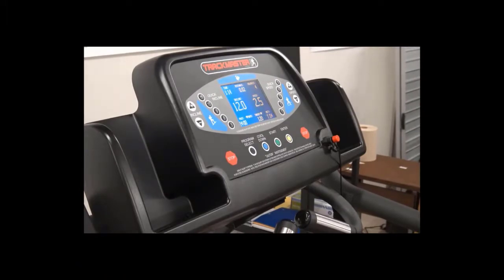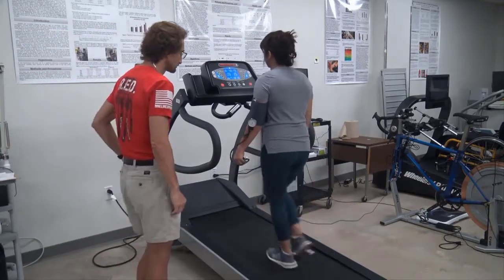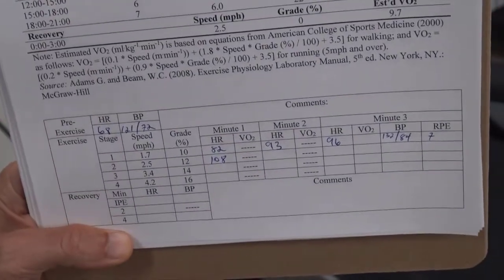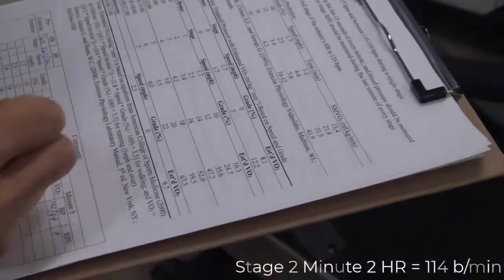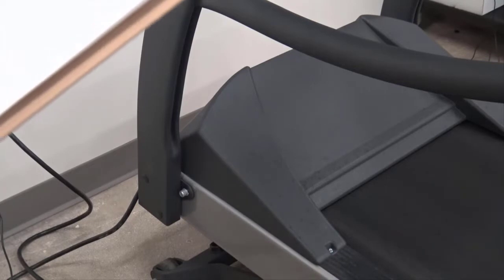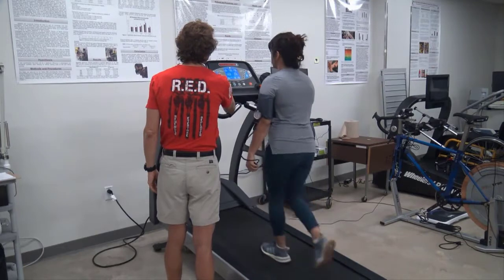The speed for the second stage is 2.5 miles per hour with a 12% grade. Continue to monitor your client and follow the protocol in the same way as in the first stage. The client's heart rate in the first minute of the second stage is 108 beats per minute, and in the second minute is 114 beats per minute. At the end of the second stage, heart rate is 118 beats per minute — only a 4-beat difference from the second minute — indicating steady state within the 5-beat parameter. Although she's above the 110 beat minimum, she's not much higher, so we will proceed to stage 3.